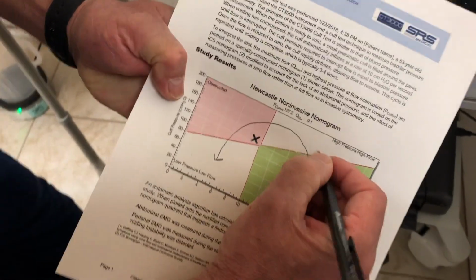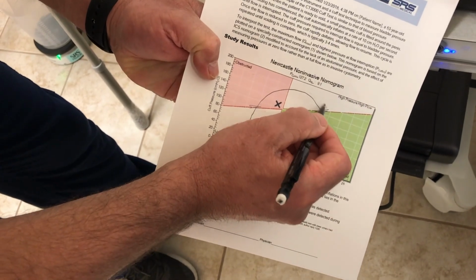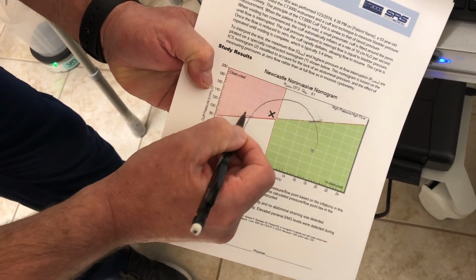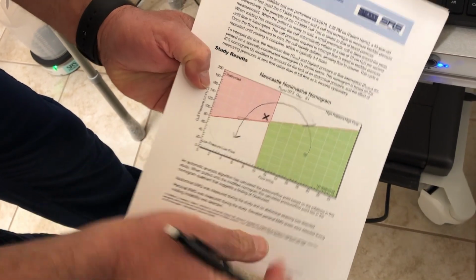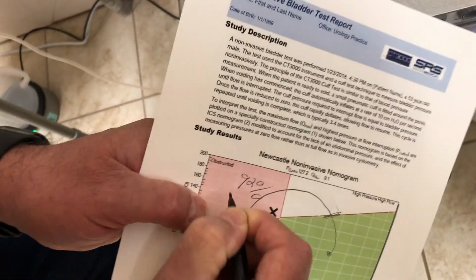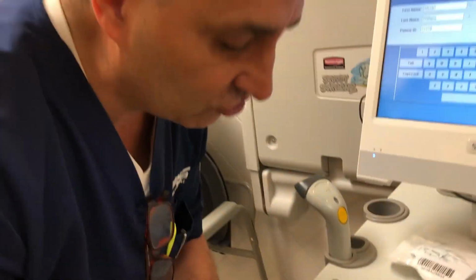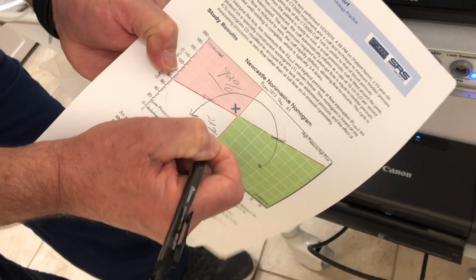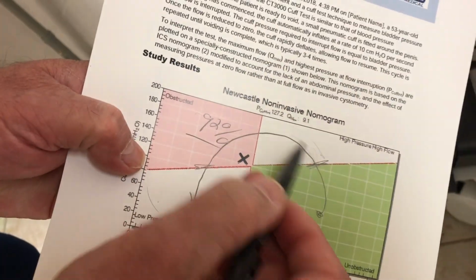We know statistically with studies that if we can intervene with this patient with a deobstructive procedure prior to him dropping into this low flow, low pressure category, you have a 92% chance of success with symptom relief with this patient versus around a 22% chance if he's to drop below the line into a low pressure, low flow.